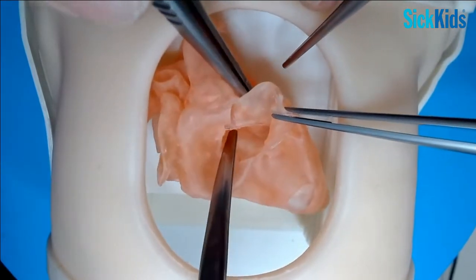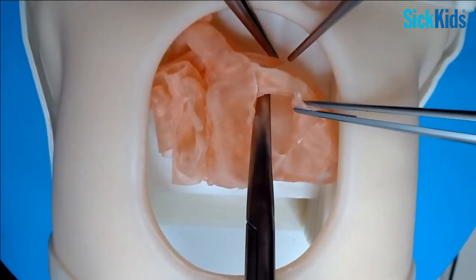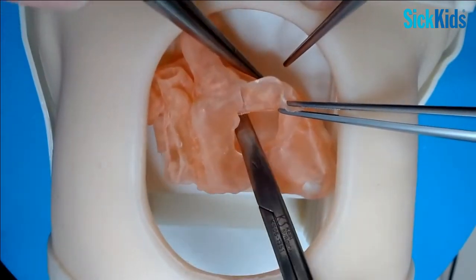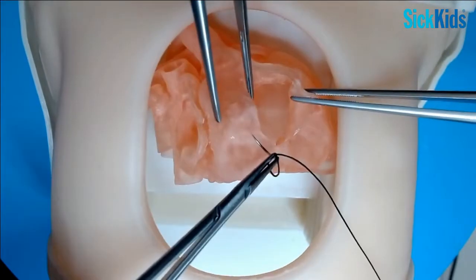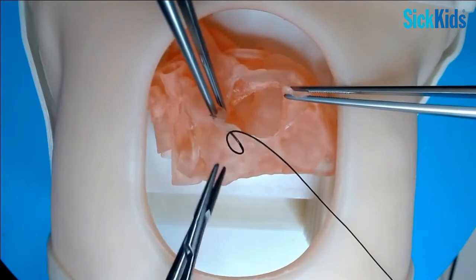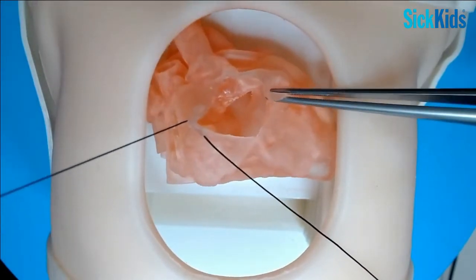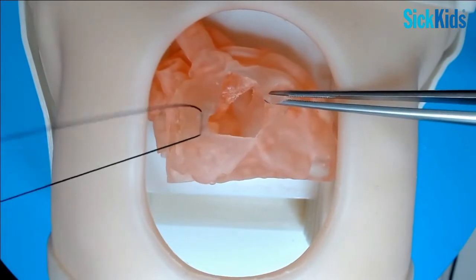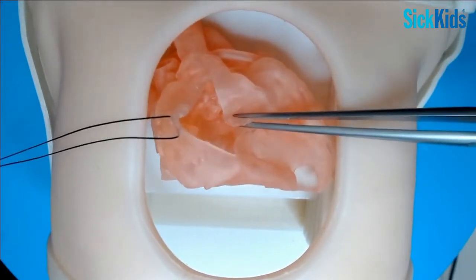I think it's a bit more secure. It's on this far distant side where it's more difficult to see what you're doing, so you just have to take your time and make sure you really understand where everything is. Certainly, you may not need to do a ventriculotomy - assessing a Taussig-Bing is always variable, and sometimes you get quite a good view through the tricuspid valve.